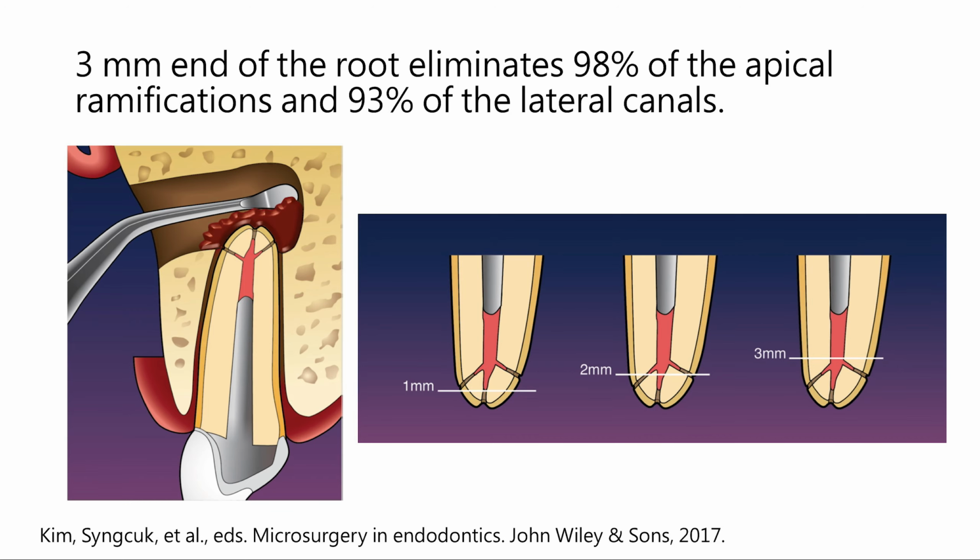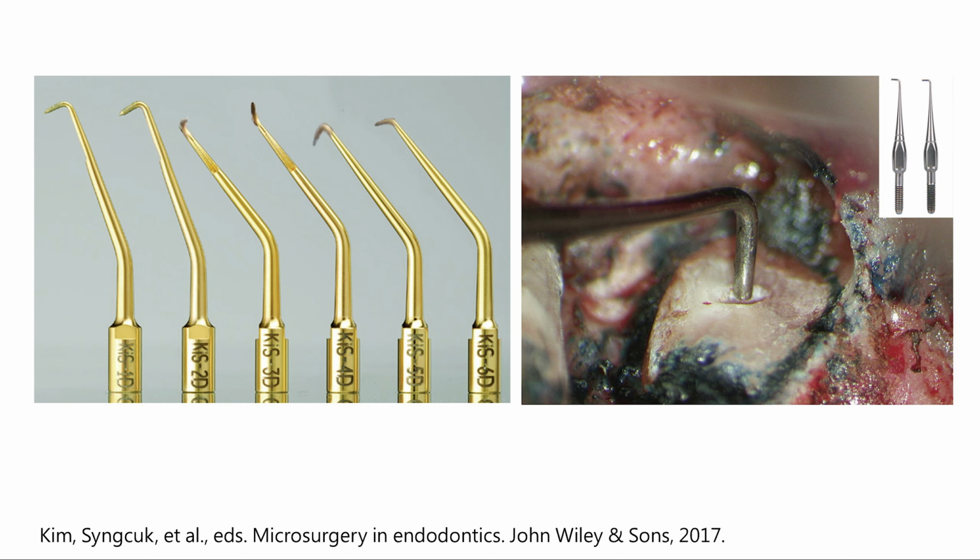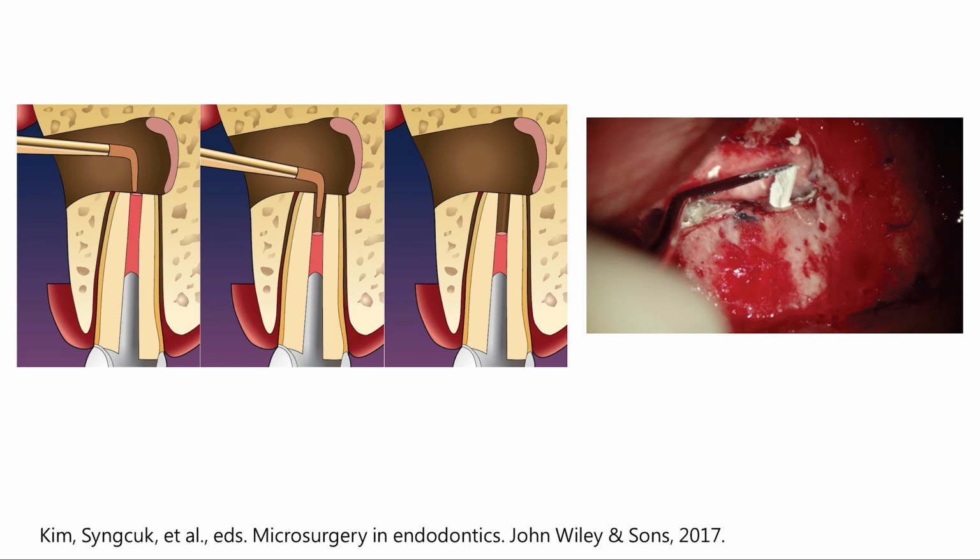This is the apical surgery of the very well-known Dr. Kim in Japan, and he says maybe a 3 mm cut, with retrograde preparation with an ultrasonic tip, and retrograde filling with any kind of calcium silicate cement. But all this is the modern endodontic treatment we know.